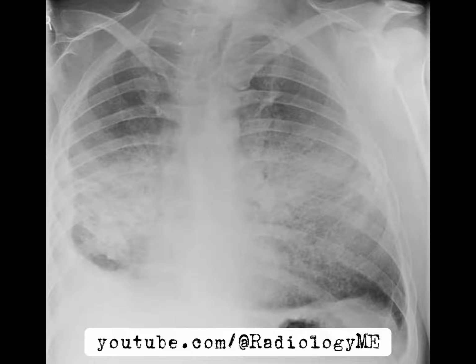So naturally, the first thing we do is grab a chest x-ray. And what do we see? Well, there's a bilateral perihilar abnormality. That's just a fancy way of saying the central parts of the lungs near the heart are showing some mixed nodular and reticular opacification. Yeah, I know, radiology terms can get wild, right? But what's even more interesting is that there's blunting of the right costophrenic angle, which suggests he might have a small pleural effusion, some fluid building up around his lungs.